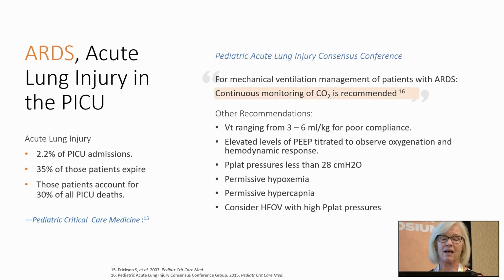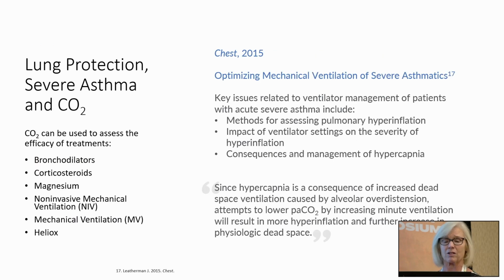One of the things that this pediatric conference does say is that continuously monitoring your CO2 is recommended to keep a close eye on what's going on with these patients, and I think that makes a lot of sense to all of us. We really want to know what's happening.